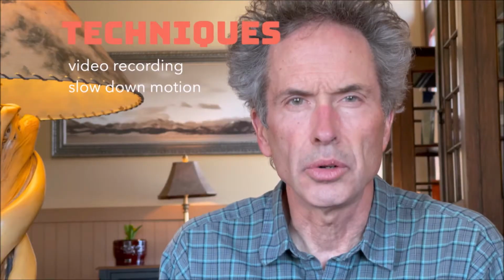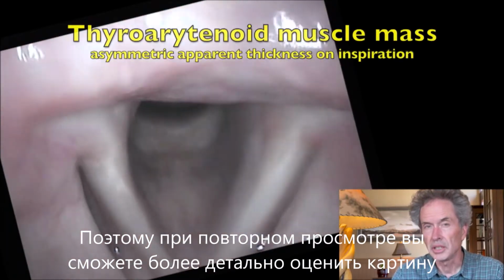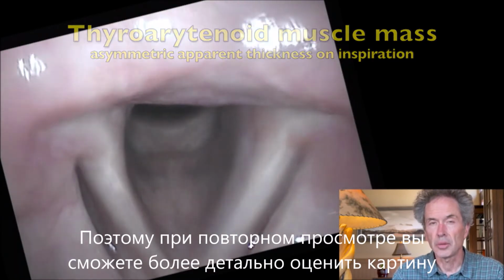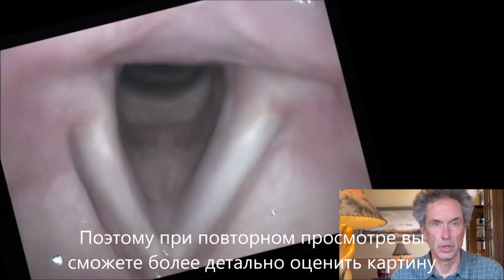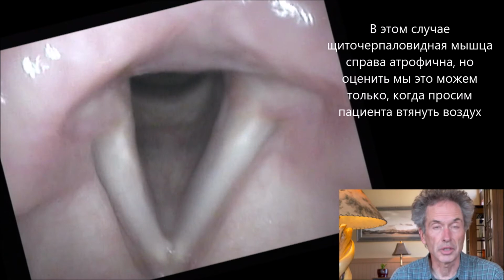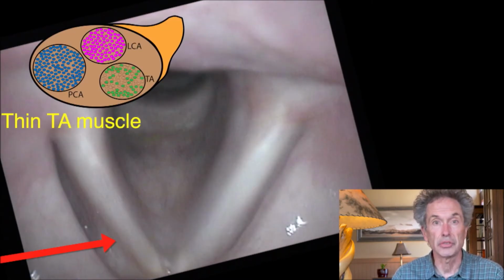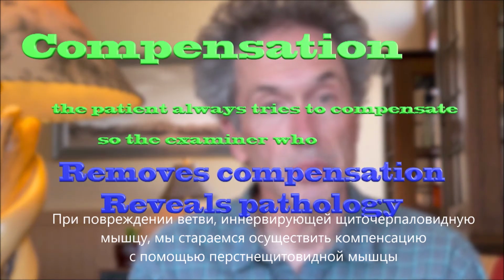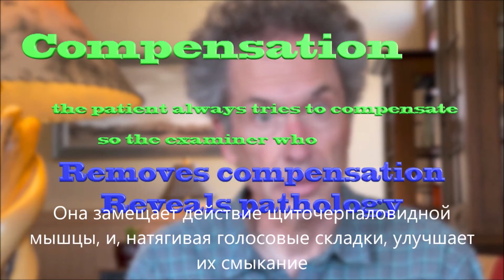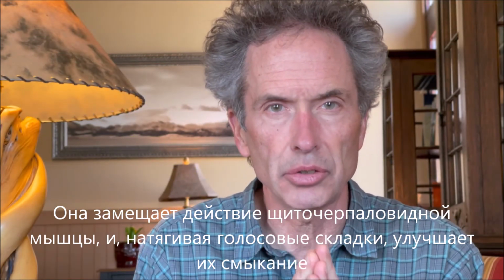Another technique, when you aren't certain that you're perceiving something, is to look at a video recording, look at it repeatedly, and slow it down, stop it where you want to get a detailed view of something. In this case, the thyroarytenoid muscle is atrophic, but we really can only perceive it well when the individual has sniffed in. With a recurrent laryngeal nerve injury to the thyroarytenoid muscle branch, we all try to compensate, and we do that because we have a cricothyroid muscle that can take part of the place of the thyroarytenoid muscle. That is, it can add tension and keep the muscles closer together.